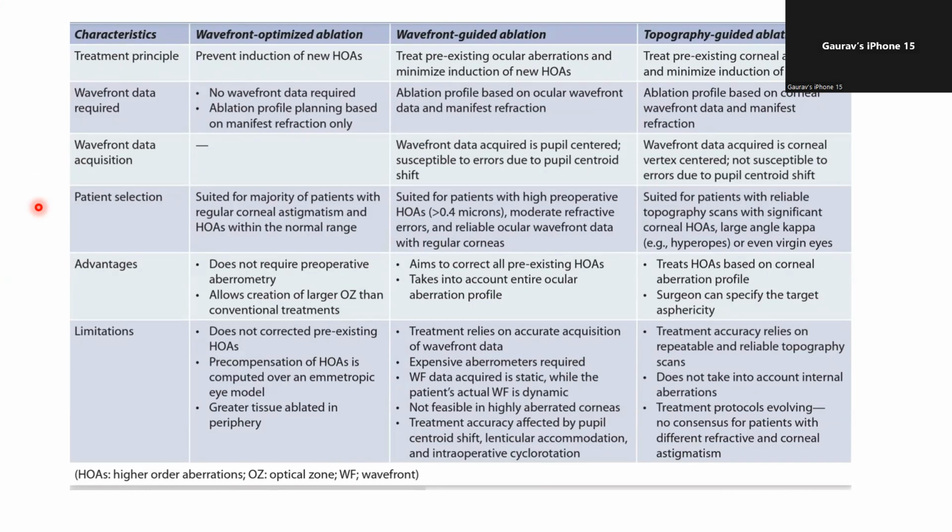I'm not sure, sir. What should we do before we start doing aberrometry for a patient if we are trying to do a wavefront guided treatment? Planning? Cycloplegic aberrometry, sir.